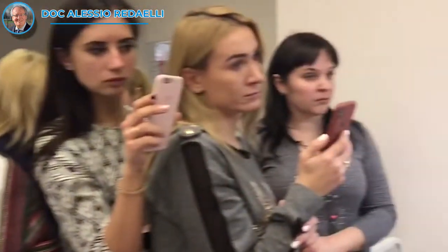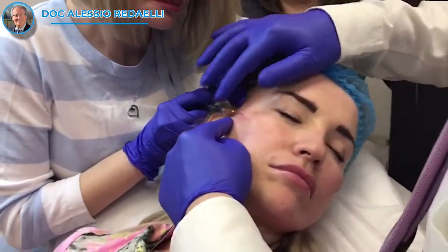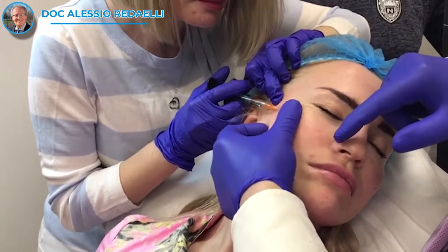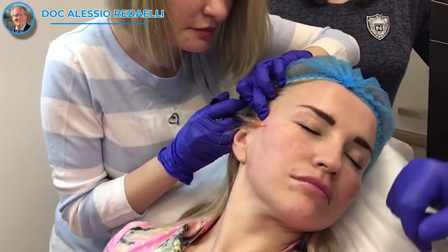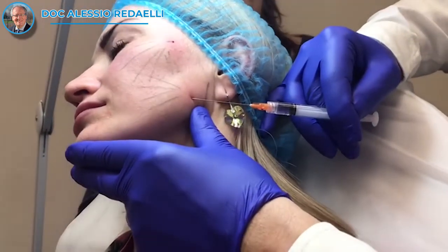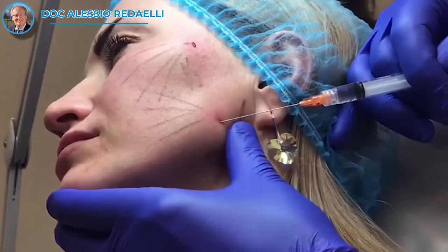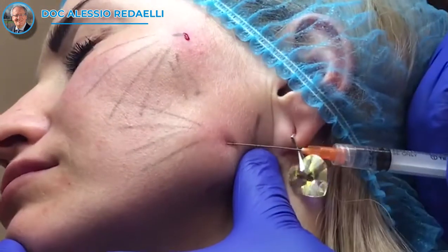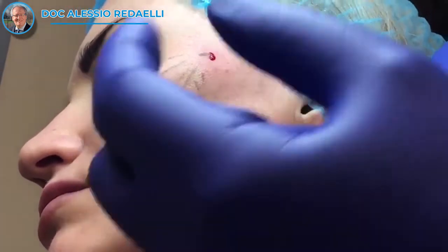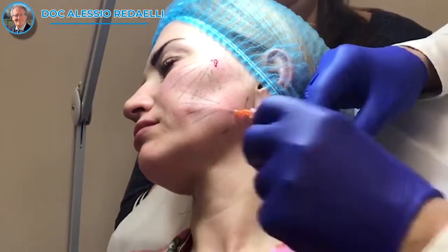And here is the eye — everything here — so remain superficial. Very good, straight, go go go. Slowly you find it. Remember to remain not too deep; you are entering in the mouth area, so pay attention.